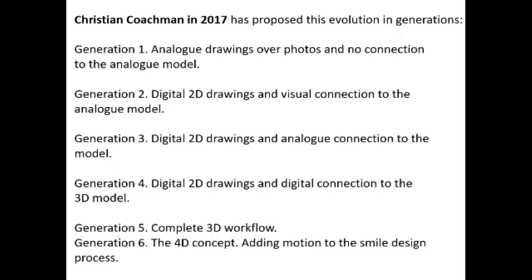In the second generation, there came digital 2D drawings, and there was a visual connection to the analog. Basically, they made digital 2D drawings and compared them with the analog model. In the third generation, the digital 2D drawings and analog connection was there with the model. In the fourth generation, the digital 2D drawings had a digital connection; basically, they were compared with the 3-dimensional digital model. In the fifth generation, it was the complete 3-dimensional workflow, which includes intraoral scans and comparing with the CBCTs, etc. Everything. So it is a complete 3-dimensional workflow.